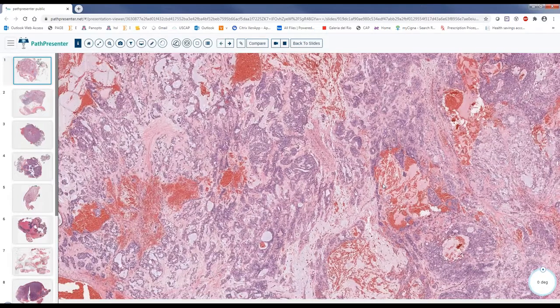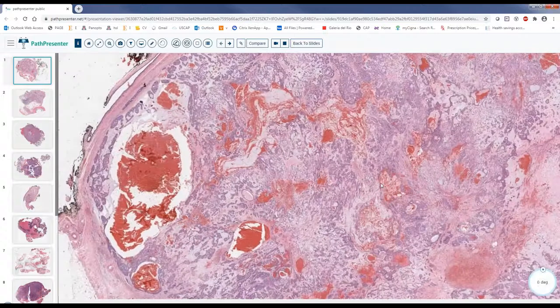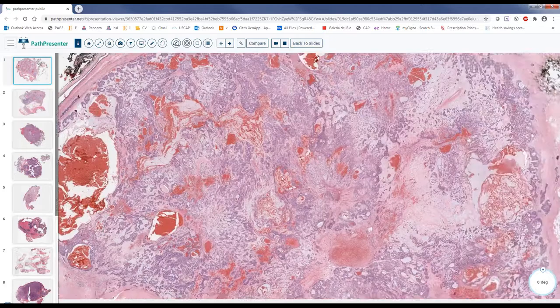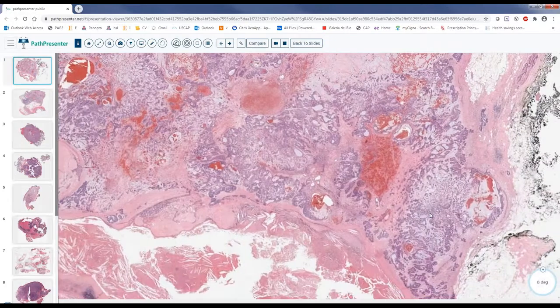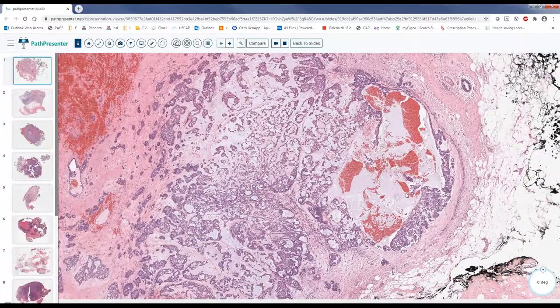Well, don't just do that. Don't just give pleomorphic adenoma, period. Try again. We check the inked margin areas, whether it is clean or not. The reason is that pleomorphic adenoma has a tendency to make something called, anybody knows what's going on?